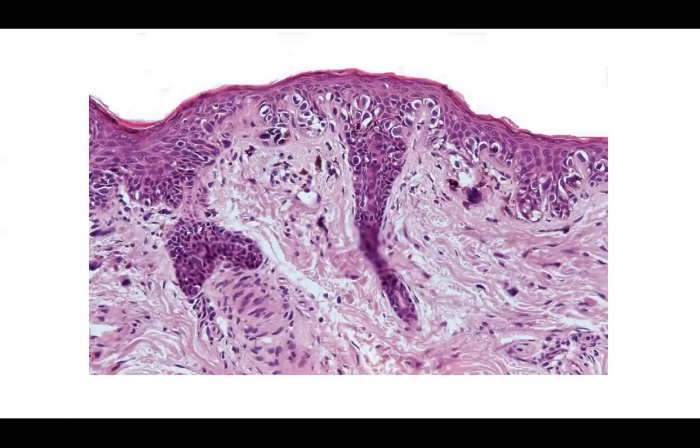There is some evidence that PRAME, which is basically an abbreviation for the long name preferentially expressed antigen in melanoma, is diffusely expressed in atypical melanocytes in most melanomas, upwards of 95% or more, based on retrospective analyses. And in my hands, it correlates almost always with the H&E staining. There are some rare exceptions both ways. However, it is a good confirmation tool, or at least a screening tool in many cases, which we'll get to.